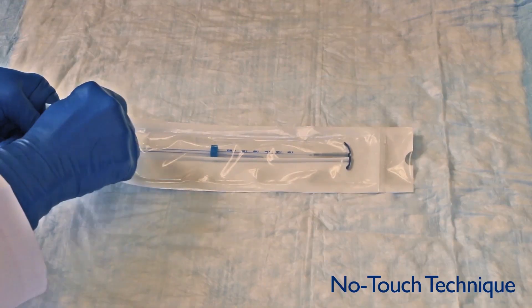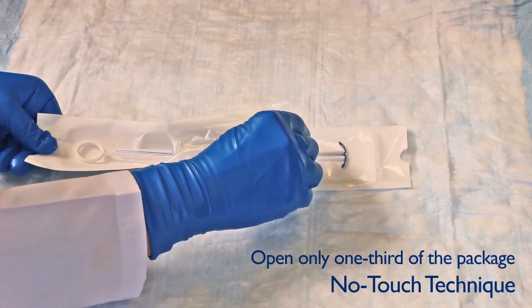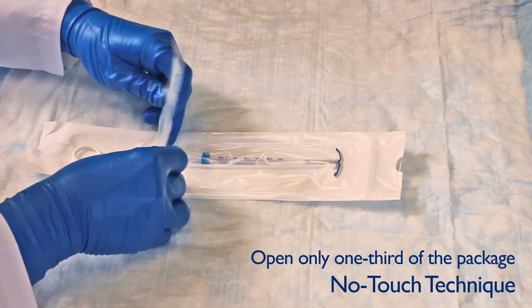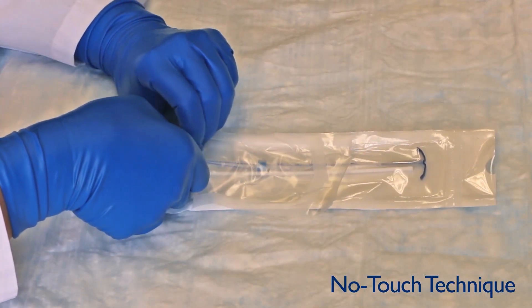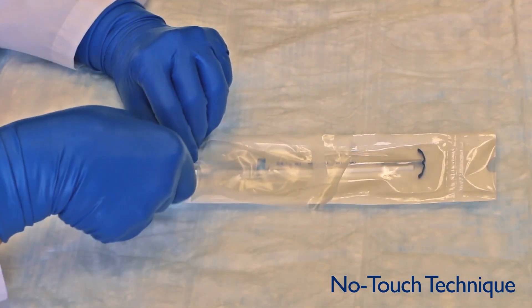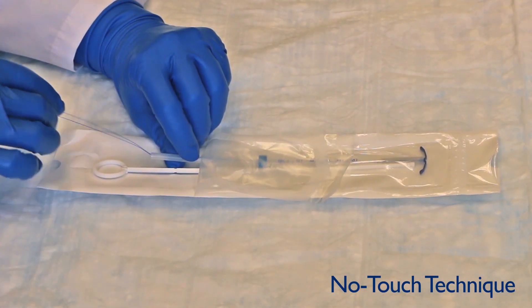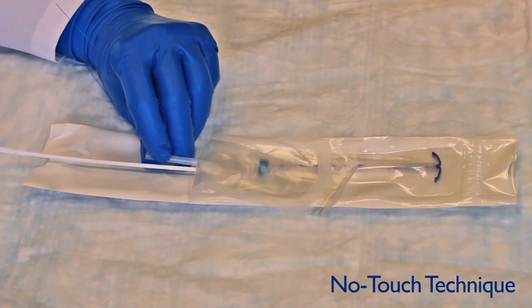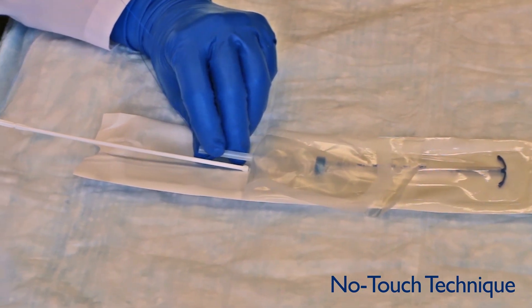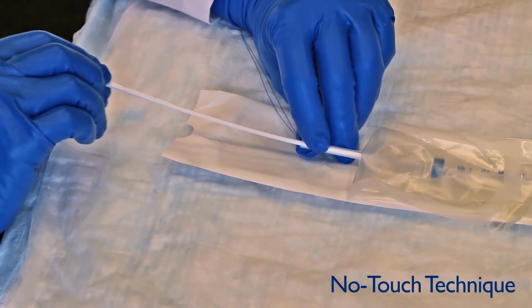Keeping the IUD in its sterile package, place the IUD packet on a flat surface and open from the bottom only one-third of the way up. Pick up the threads to remove them from the flange and hold the threads and insertion tube with one hand. Use the other hand to remove the rod from the package and insert it into the insertion tube until the tip of the rod is at the 5 cm marker.